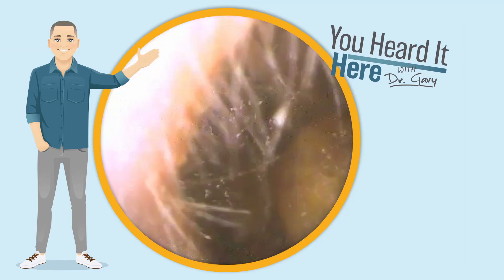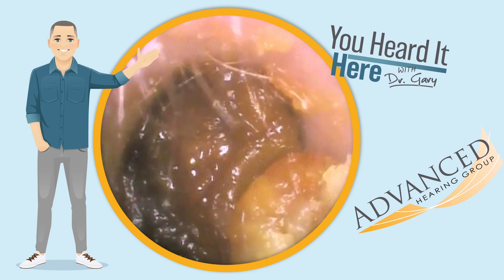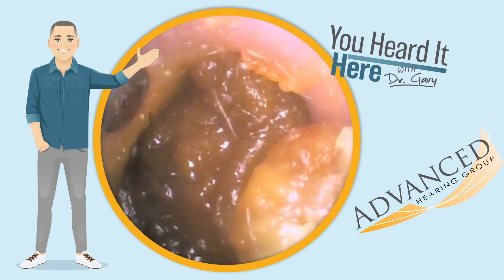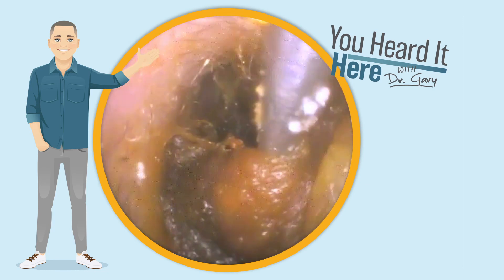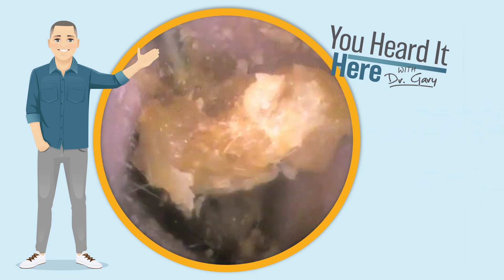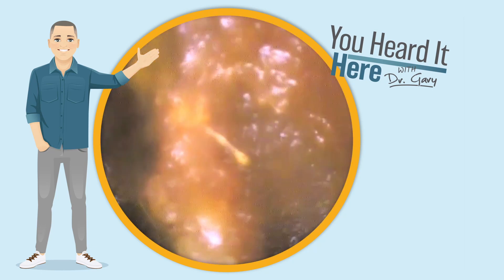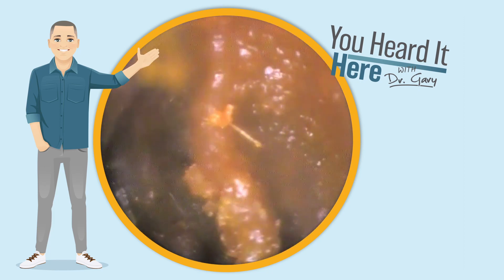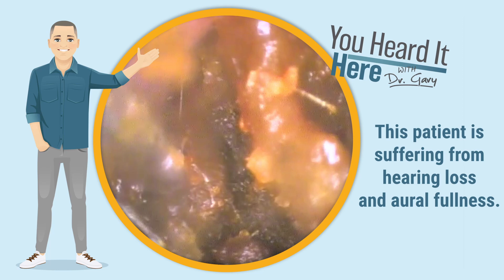Welcome back to You Heard It Here with Dr. Gary. I'm Gary, one of the clinical audiologists and part of the ownership team here with Advanced Hearing Group in Scottsdale, Arizona. This is earwax removal vlog number 62. In today's episode, we're going to use the curette and some irrigation to remove some severely impacted wax and provide a patient with some much-needed relief from the hearing loss and aural fullness that they're suffering from.